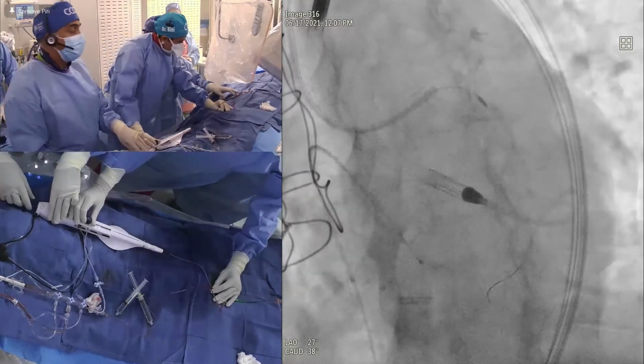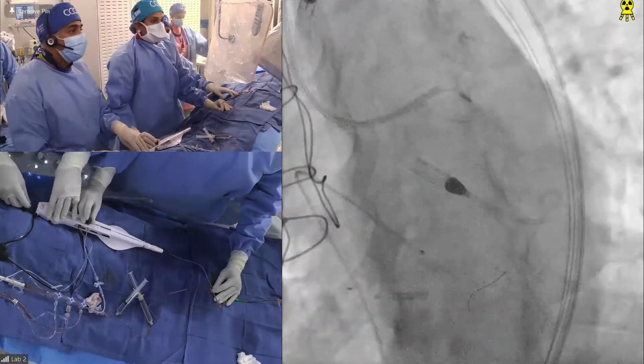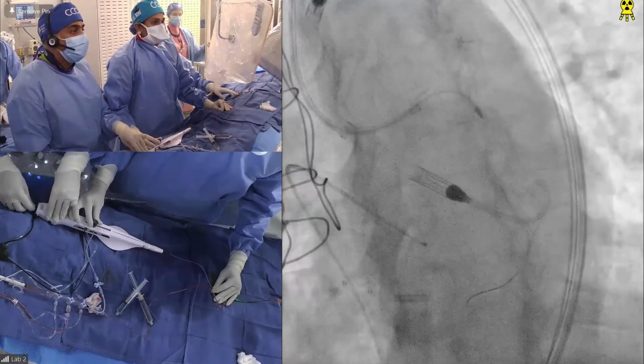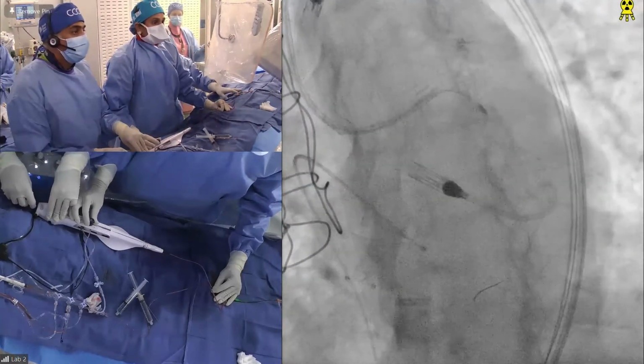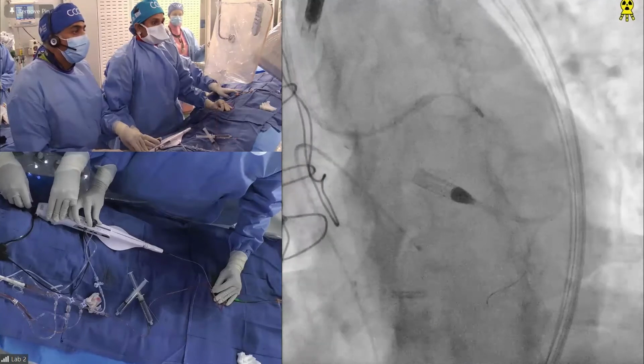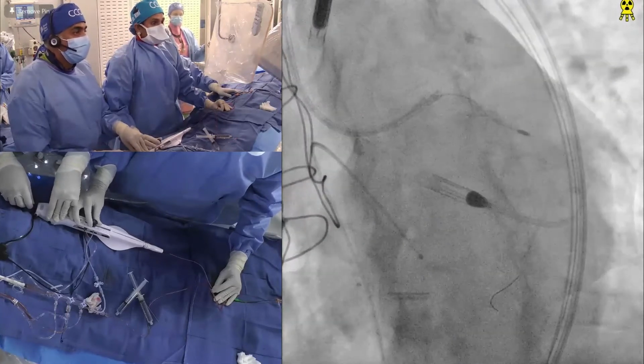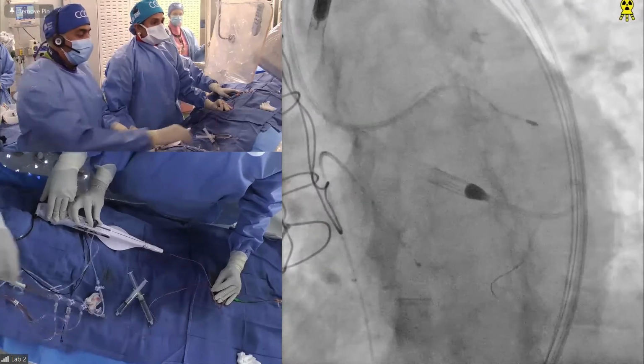Any question? Should we have used something to de-stress the angle? Basically the wire is biased on one side so that it is not cutting the wire. Yeah, which has happened, and of course the burr is stuck. Yep. We see that it went through.